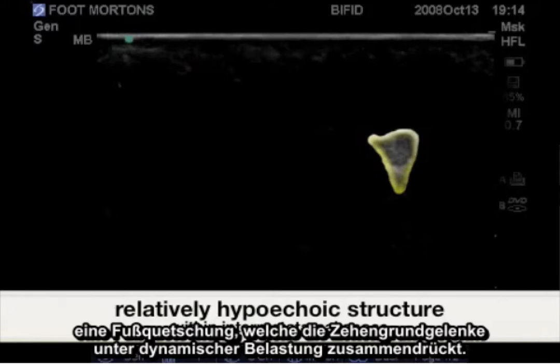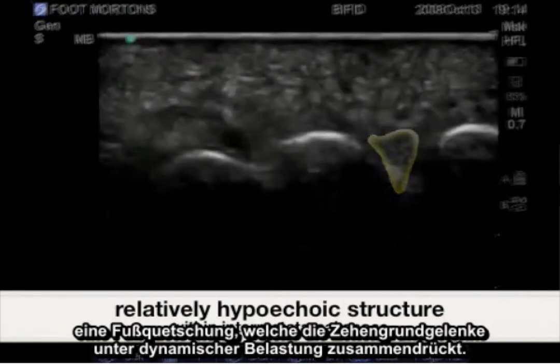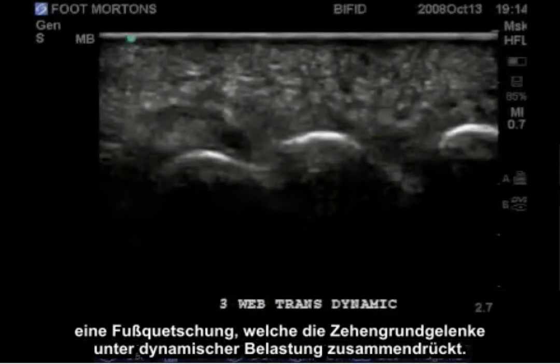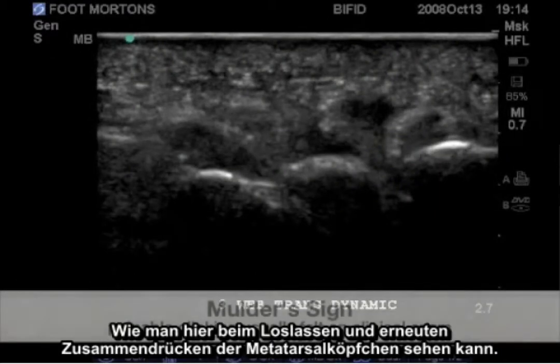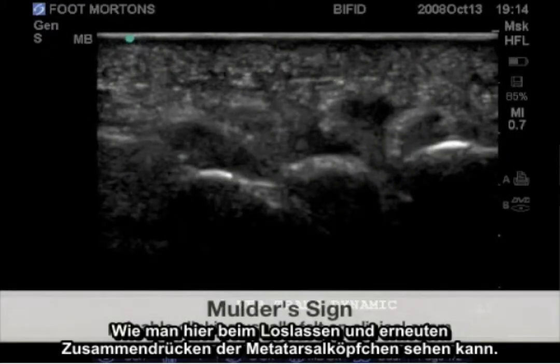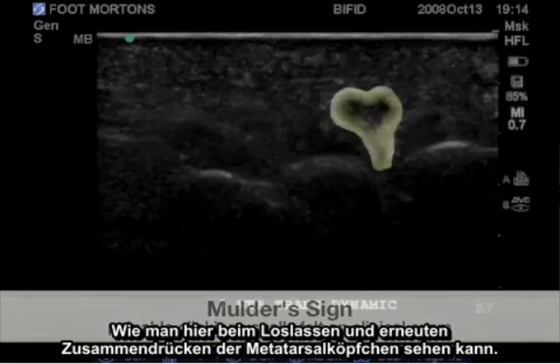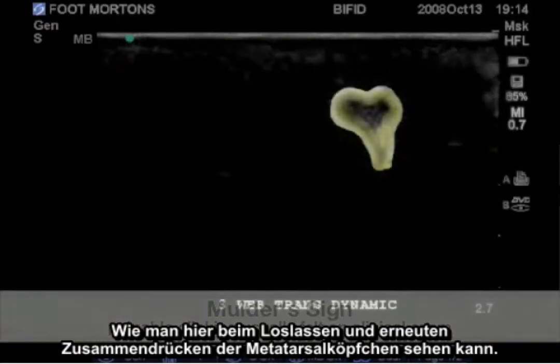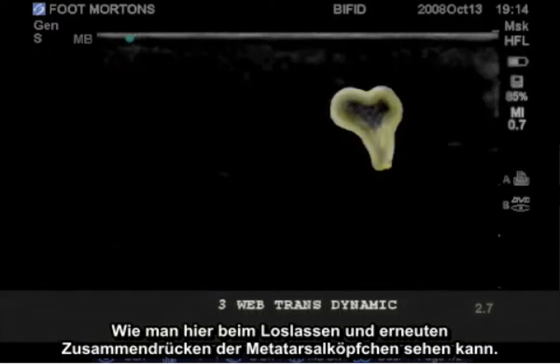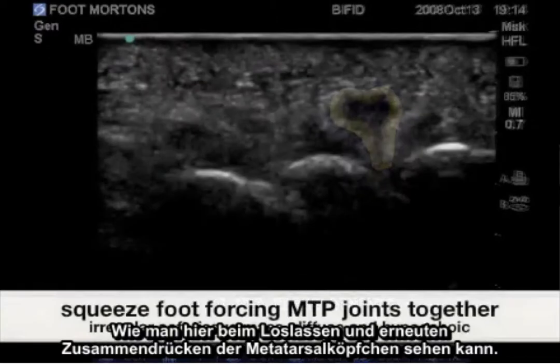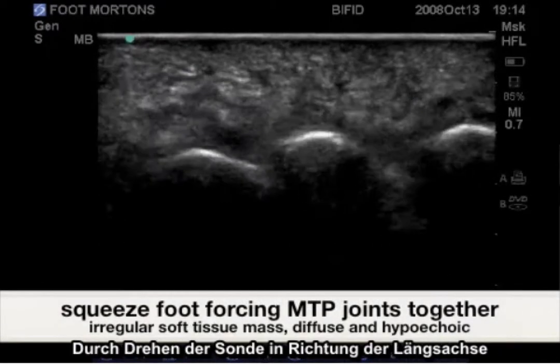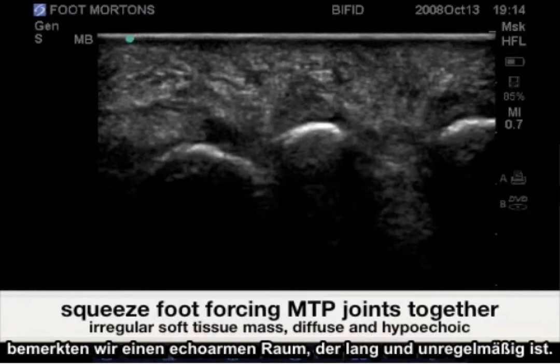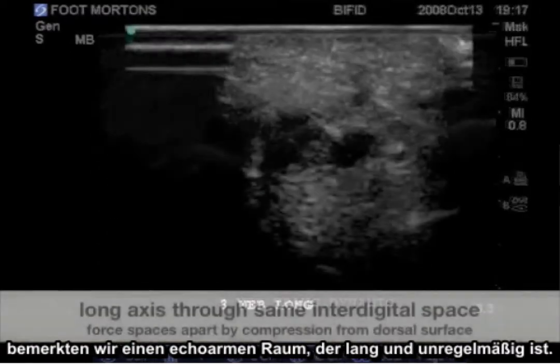A positive Mulder's sign involves squeezing of the foot, bringing the MTP joints together under dynamic stress, as seen here — with releasing of the metatarsal heads and forcing them back together.